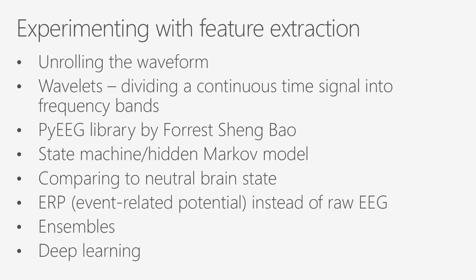I honestly think this problem could be solved by deep learning, because when you think about it, this problem is waveforms, right? And everyone has a unique signature, but this is basically the same problem as voice recognition, speech recognition, because you guys have all seen audio files, right? And this is what our voices sound like, and everybody has a slightly different voice. But if you do the normalization work across that, you can break down those waves and distinguish words from that. And so that problem has been solved by deep learning.